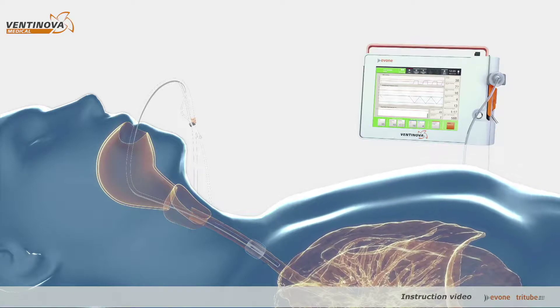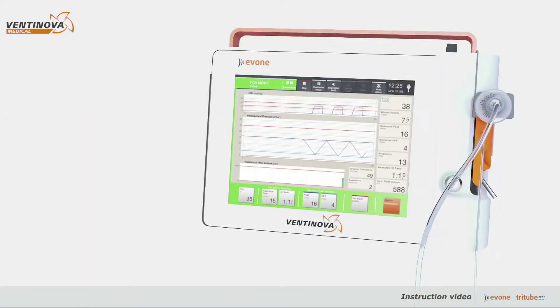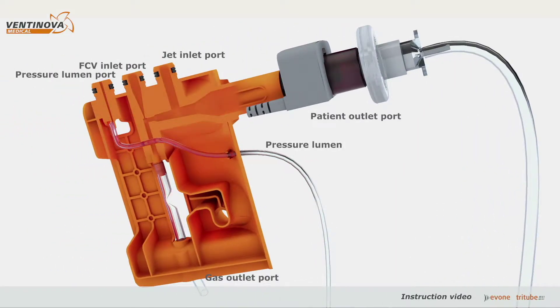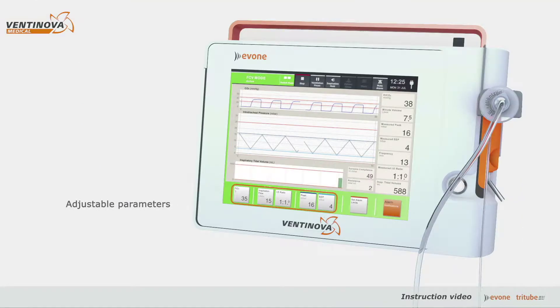The typical linear increases and decreases in intratracheal pressures are caused by the unique ventilation technology inside the cartridge, which is called FCV. At the bottom of the screen, the adjustable parameters are displayed. Measured parameters are shown at the right-hand side.